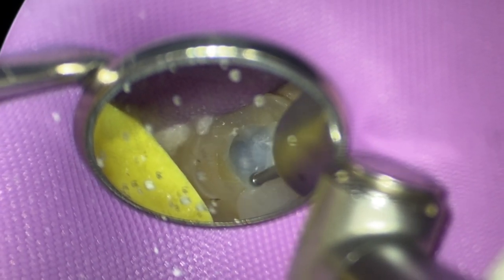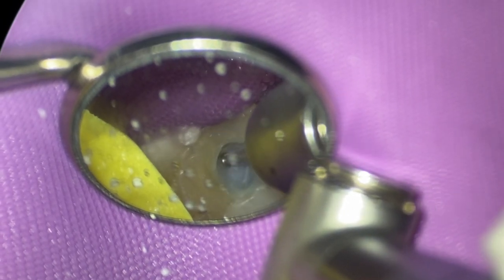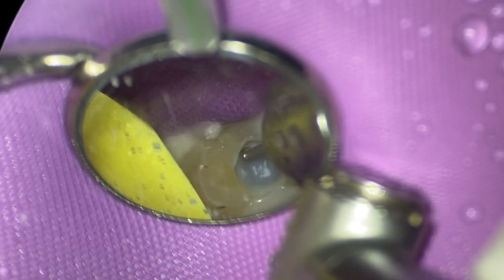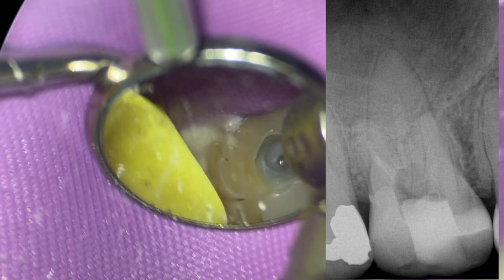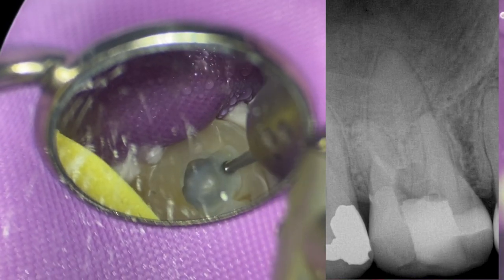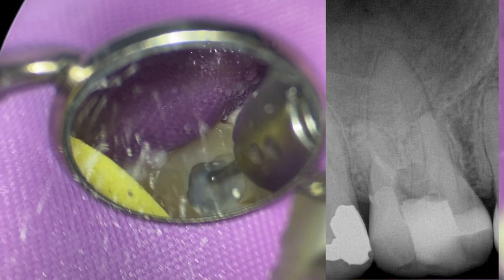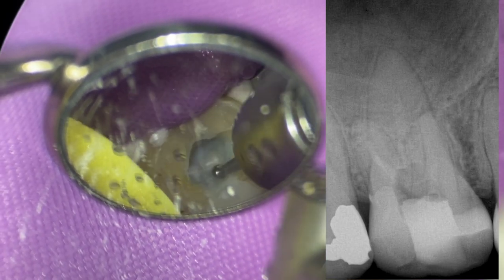I wanted to share this case with you because it took a bit of planning, some time to get into this MB2. Honestly, at one point my initial sitting with the patient was like, wow, I don't think we're going to be able to find MB2. We'll have to approach this from a surgical standpoint, but we were able to get down it. Perhaps because I got down it, I wanted to share it with you.